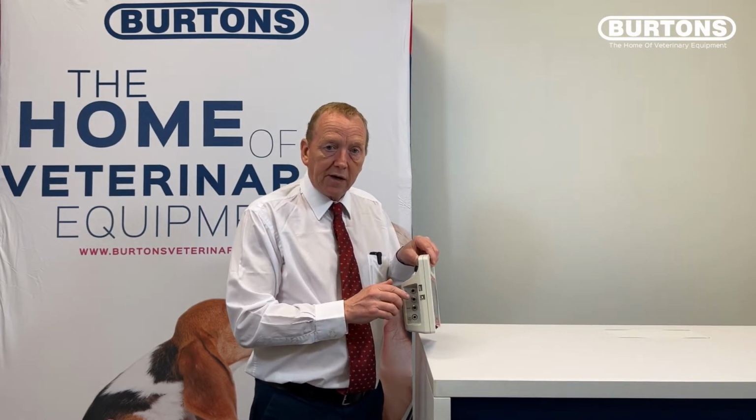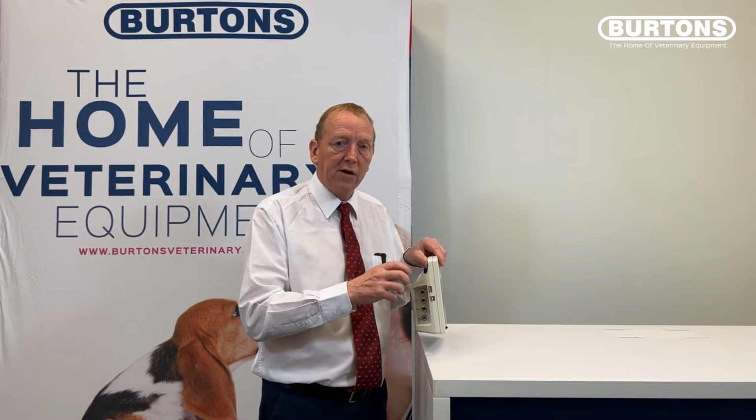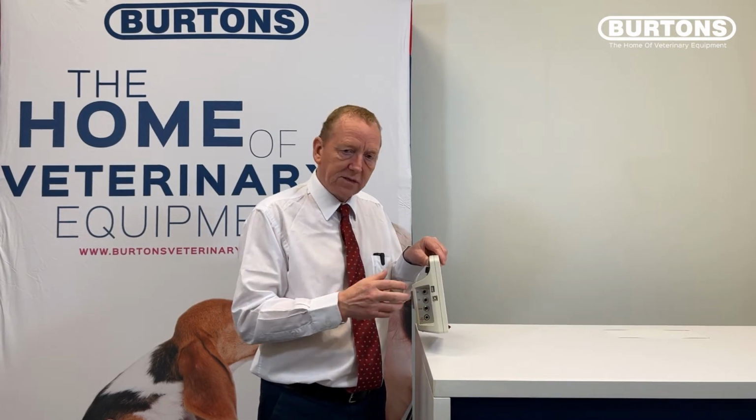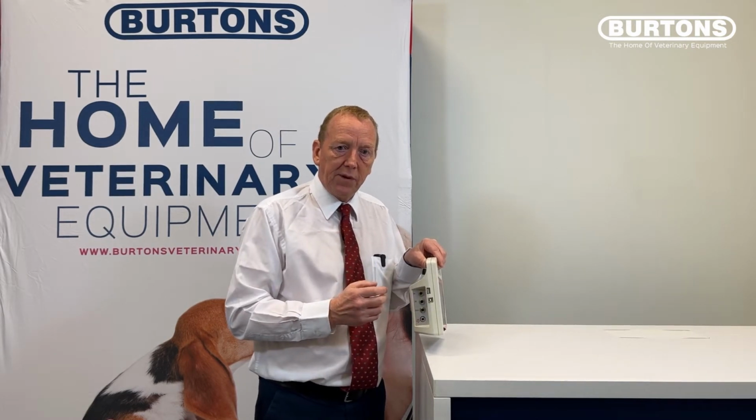They're both USB connections. One is a USB type A, and this connects from here to a PC or laptop to enable all of the data from here to be fed to a PC. In a future video, or another video that follows this series, we'll be looking at how we use that data and store it on the computer.